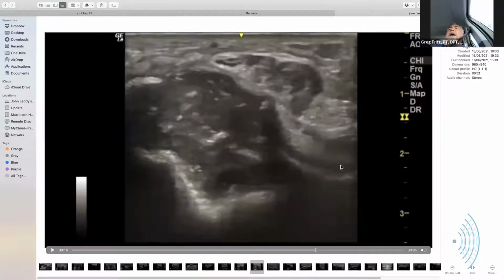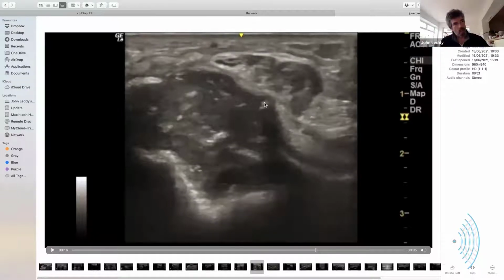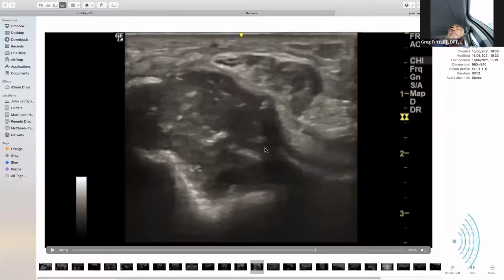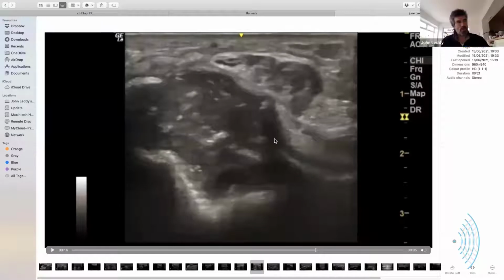Yeah, that's the trochlea, the olecranon trochlea. So follow the bone up, and what should you get there? I don't know the answer to that, John. It shouldn't end at a tip. Do you see how the bone ends in a tip there? Yes. Oh, wow. There should be a fascial or a thickened ligament there. No. But you should get bone. The bone should carry on. Bone doesn't end in a spike.